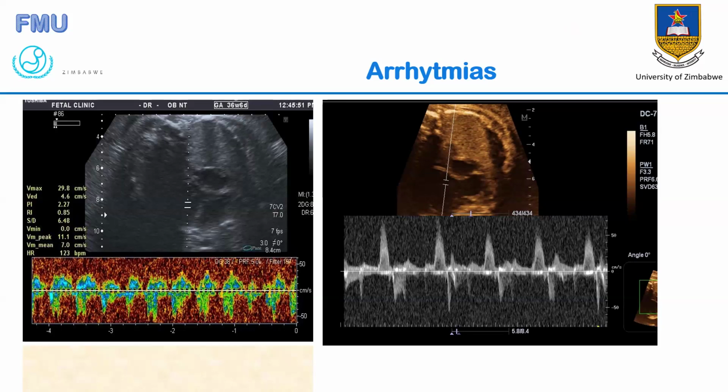What is abnormal, right? So Mukala has already said the first one is an ectopic. Yeah, certainly there's an ectopic beat which is interrupting. I will show people where the ectopic beat is. What about the second one?